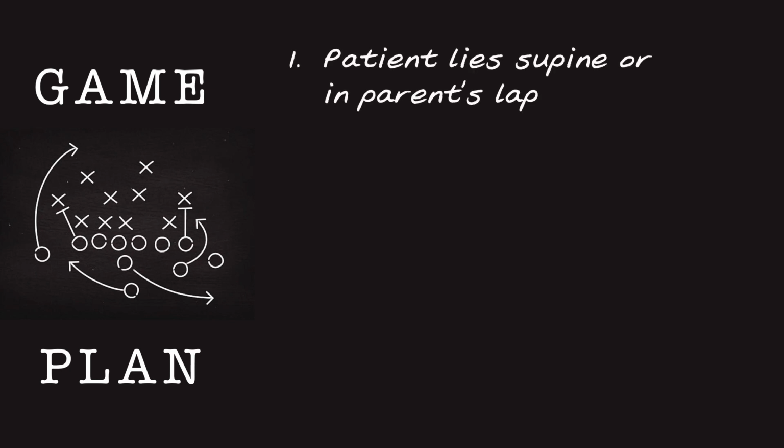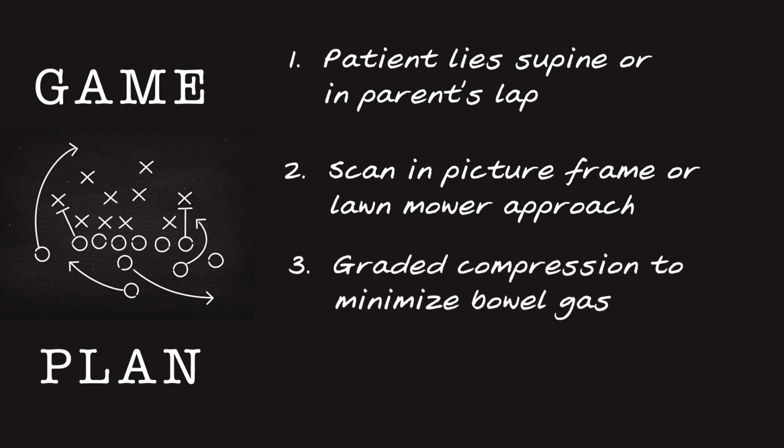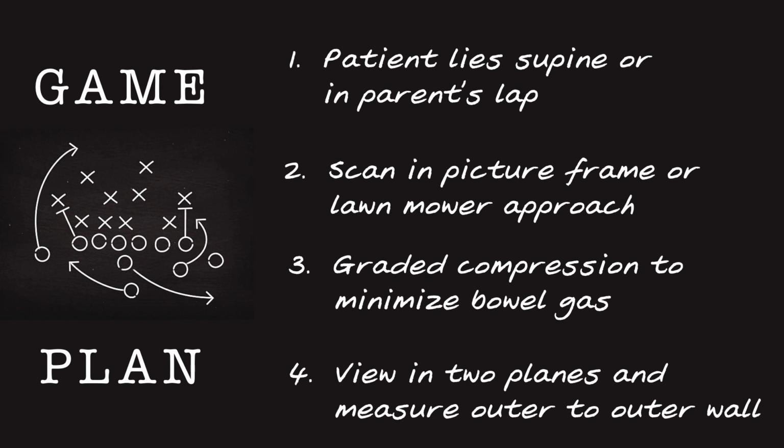Our game plan is to have the patient lie supine or in the parent's lap for comfort. You can scan in the picture frame approach or the lawnmower approach. And again, you're going to be using graded compression to help minimize the bowel gas. You'll also want to try to visualize in two planes and measure the area of concern from outer wall to outer wall.